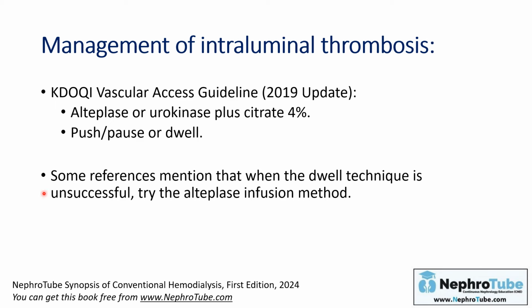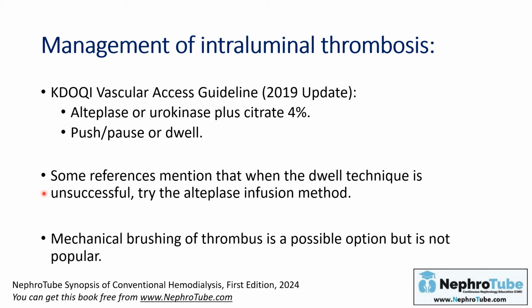But actually, the infusion method is very difficult, sophisticated, and has a lot of complications. Finally, mechanical brushing of thrombus is an option, but actually it is not that popular. Let's talk about what the push-pause method is, what the dwell method is, and how to use them.